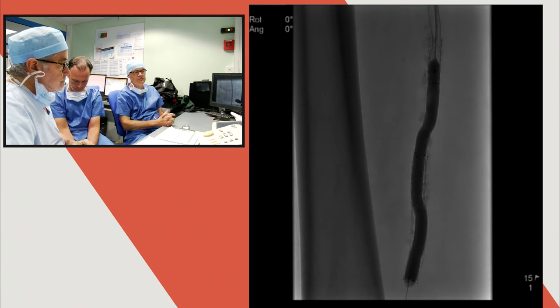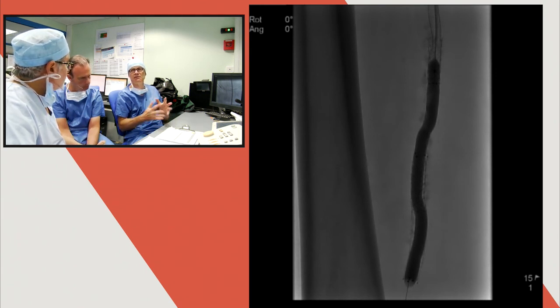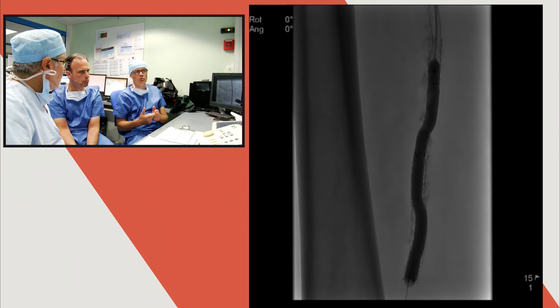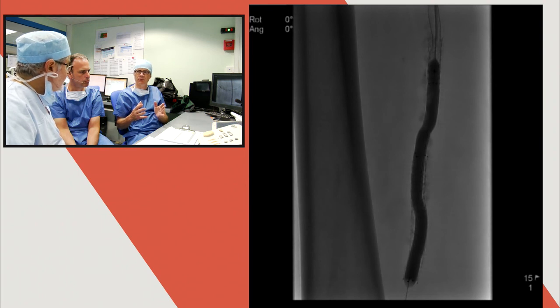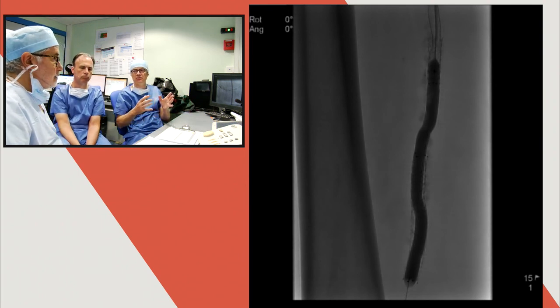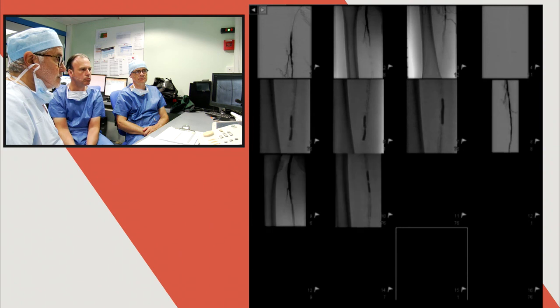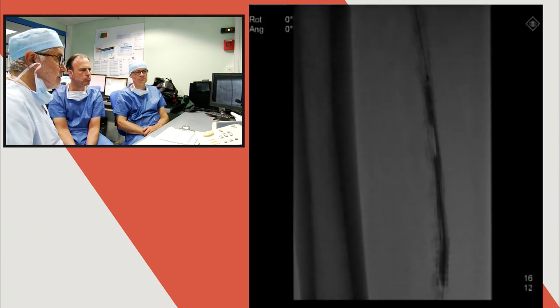Well, what we learned from plain balloon angioplasty is that longer balloon inflation times do reduce acute dissection, the percentage of dissections, and as well the severity of dissections. That's the reason why we inflate every kind of balloon for at least 3 minutes. It's not only for the drug-eluting balloon, it's even for a bare balloon, if we decide to stay with bare balloon only. So it's not the drug release which is improved with the 3 minutes, it's simply to improve the acute balloon angioplasty result. So what we did after is apply the 6 millimeter balloon all along the Eluvia stent.